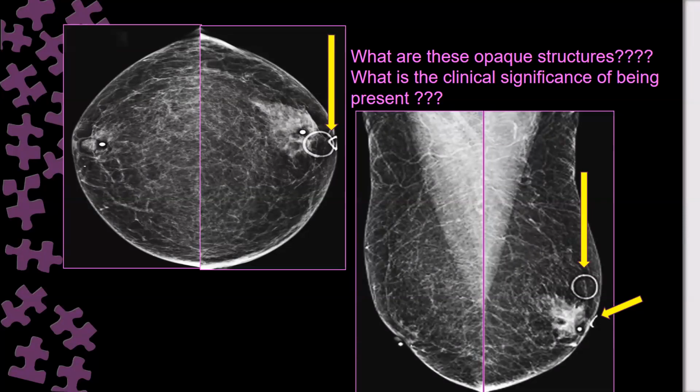Excellent, well done. For a palpable abnormality, usually a triangle is used. Why is it a triangle with a lucent center? When it is projecting inside the breast, so as not to obscure the associated calcification within the mass. You can see through it the calcification within a mass.